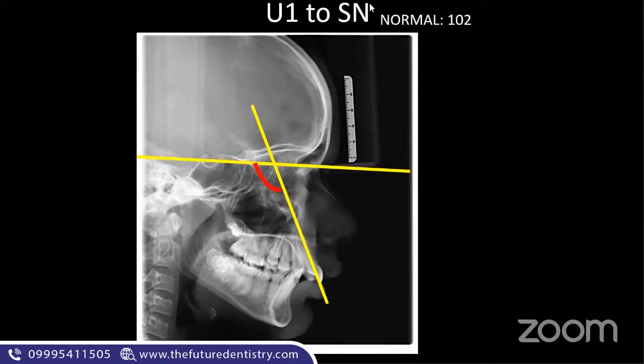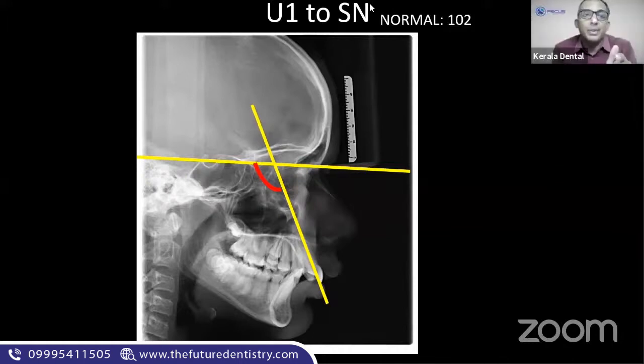Now, let's look at this patient sitting in front of us. Let's take a protractor. Those who have already joined Focus, I have sent a PDF, and the PDF has a printout of all these x-rays. You can take a protractor, you can measure it if you want at this point of time. This is a learning process, guys. I would like you to learn and understand it in such a way that you'll never forget.